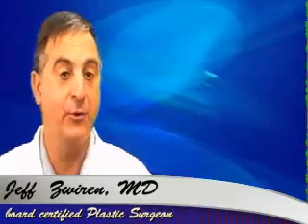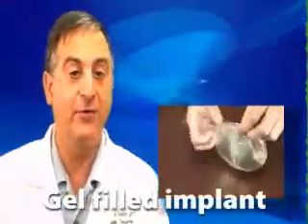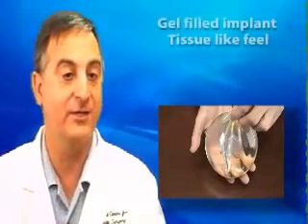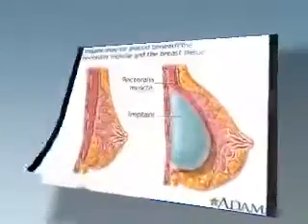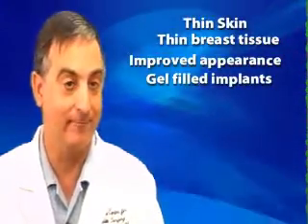Both implants are good, both are effective, and can give excellent results. When compared, many patients feel that a gel-filled implant feels a bit more natural. The gel-filled implant has more substance to it. It tends to feel a bit more like breast tissue. From a purely aesthetic standpoint, a gel implant seems to more accurately mimic the natural breast tissue, especially in a woman with small breasts who will not have much soft tissue to cover the implant. Thin skin coupled with thin breast tissue will usually get a better result with gel.